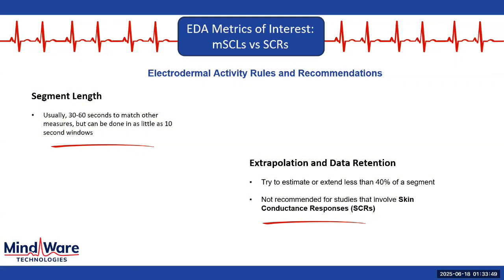Our general overall rule or recommendation for this would be: do as little as possible. Over-editing skin conductance data is very common, but the effects of doing so can certainly increase the likelihood that we don't see the effect that was actually there, and also create study replication issues by using different protocols.